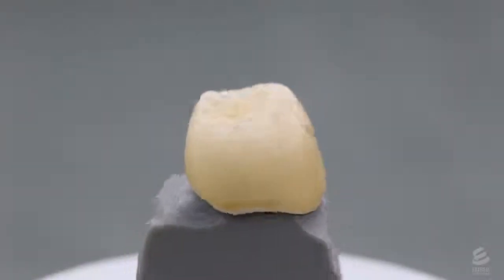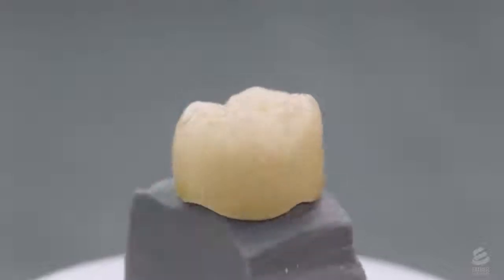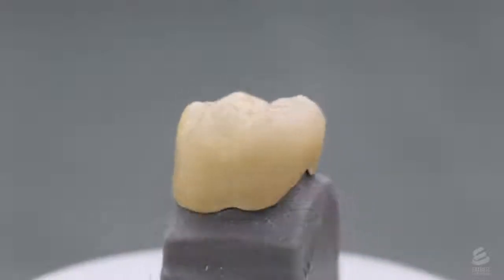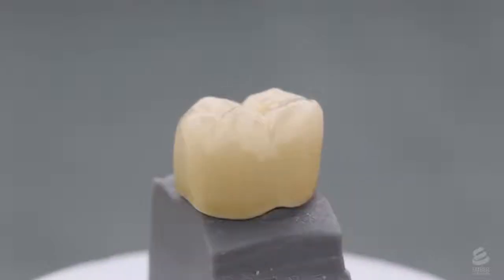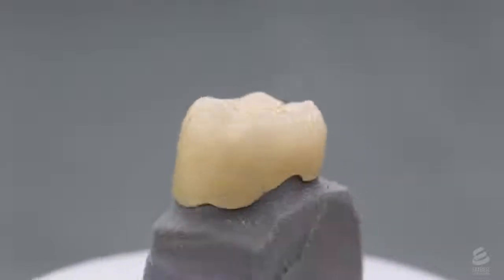The crown goes through some finishing steps, including detailed painting and glazing, which gives the crown a natural, tooth-like appearance. It is now ready to be shipped back to the dentist, who will place it in the patient.